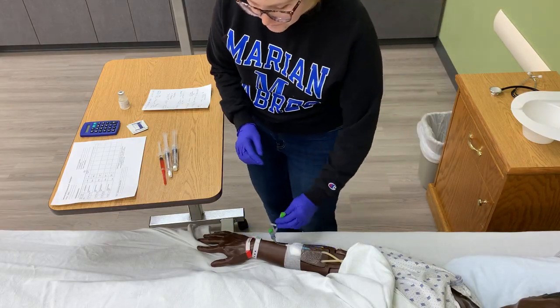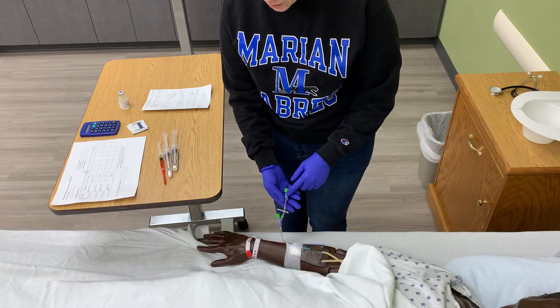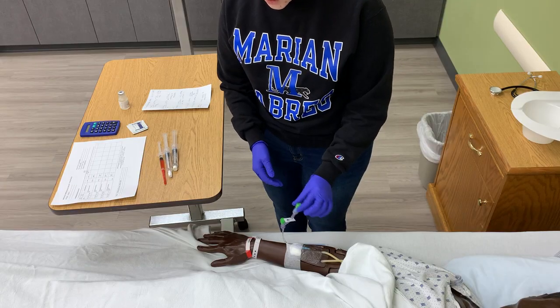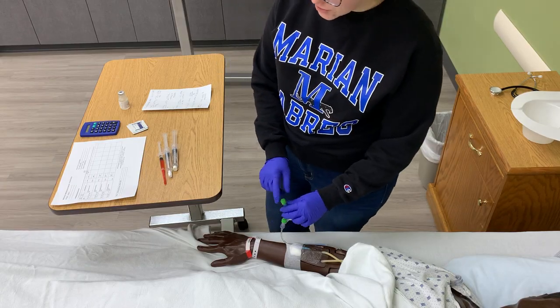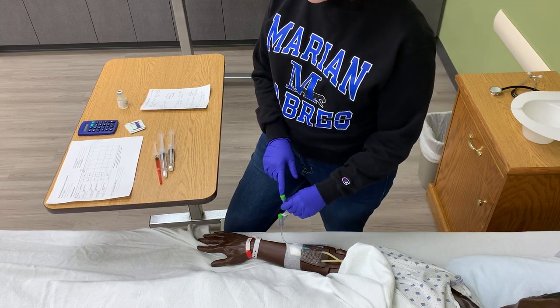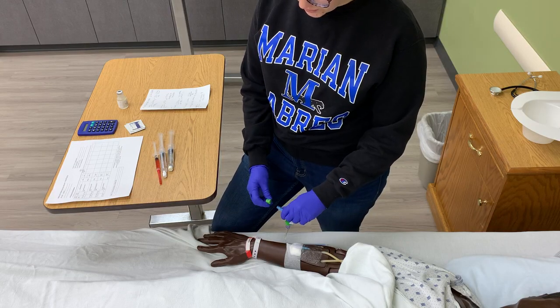So that's good. So when I attach my IV flush, I'm gonna pick the port that's farthest away from where it enters the patient. So I'm doing this one all the way over here. It has a green cap on here. If it did not have a green cap, I would be cleaning with an alcohol swab for 10-15 seconds. So I'm gonna take this off without crossing over.